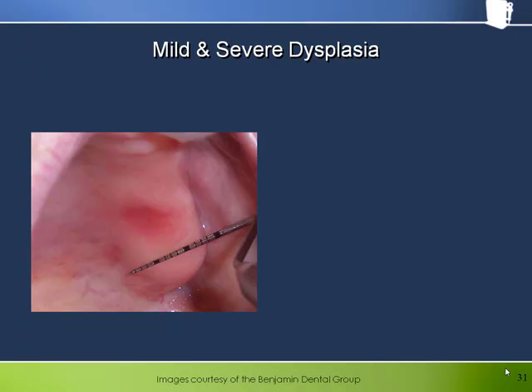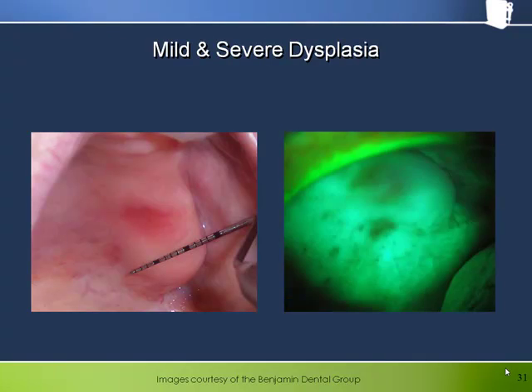This is an example of a patient who presented at a private practice with an erythematous patch beneath a denture. When examined through the Velscope, a second, smaller patch became quite evident as well. Because of the unusual appearance under the Velscope, the clinician biopsied both areas.